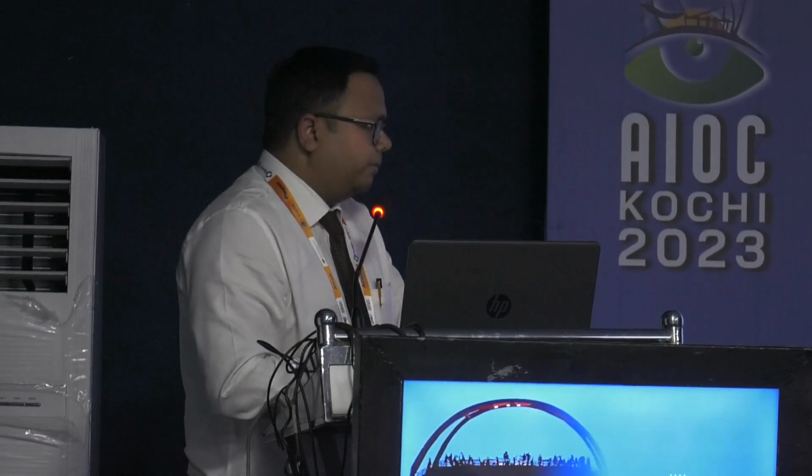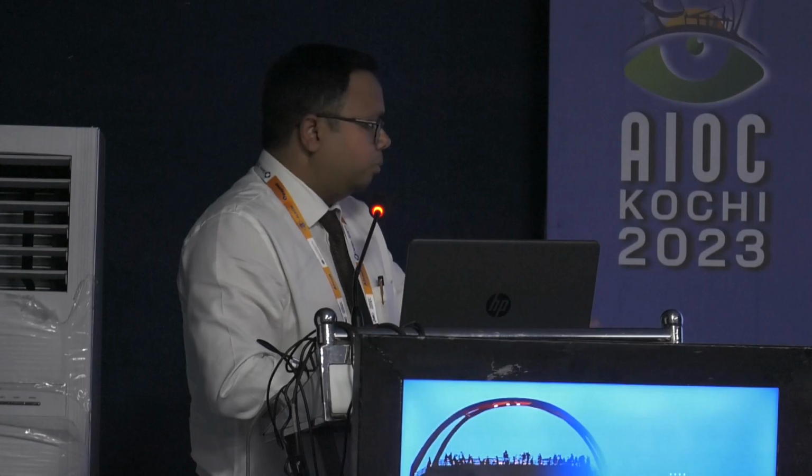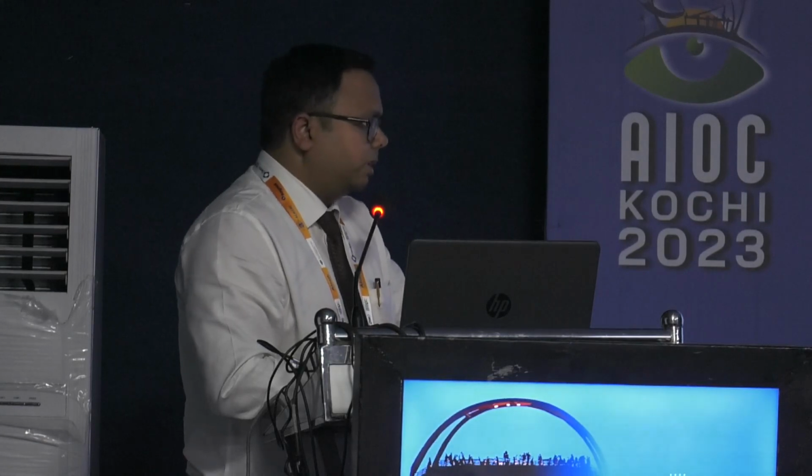I have 18 months of follow-up, and none of the cases has shown any major deviation or any major tilt of the IOL till now. Actually, stability is not the issue. The issue is astigmatism, with the IOL a little deviated to one side. Astigmatism is there in most of the cases. If you are getting astigmatism up to 1 or 1.5, that's acceptable for SFLs. If the astigmatism reaches 3 or more, that is always a cause for concern.